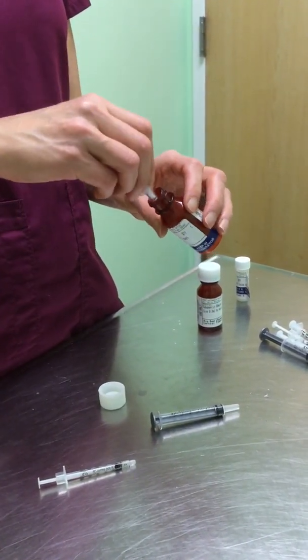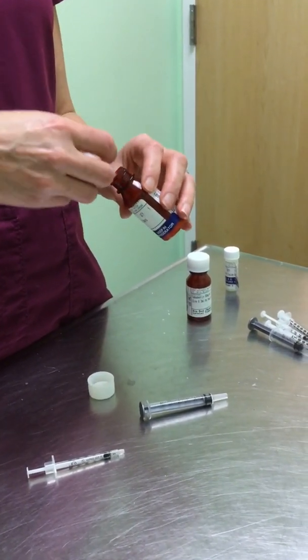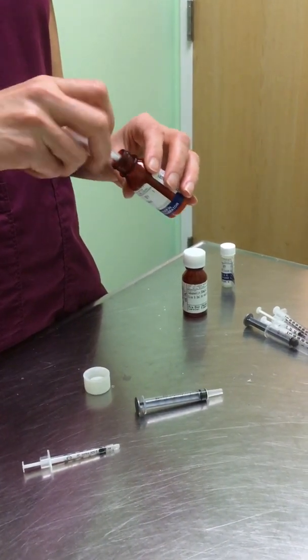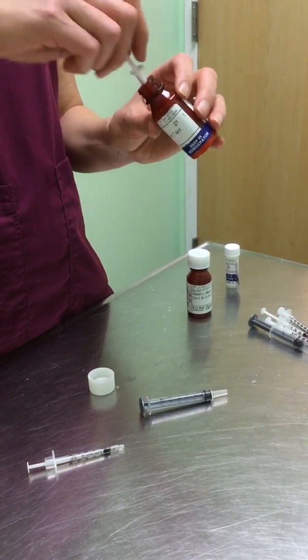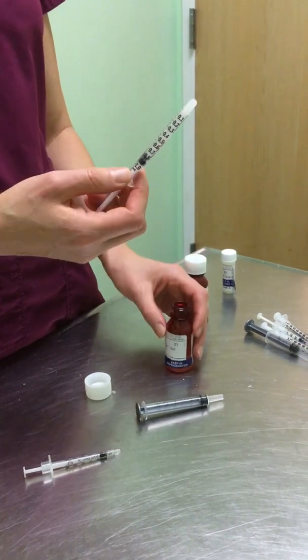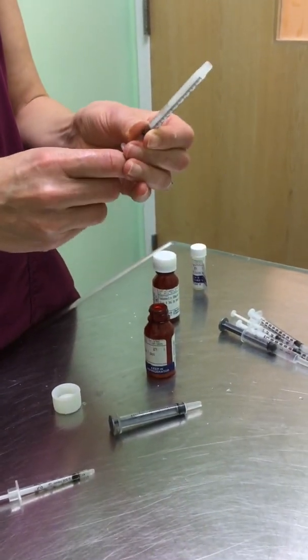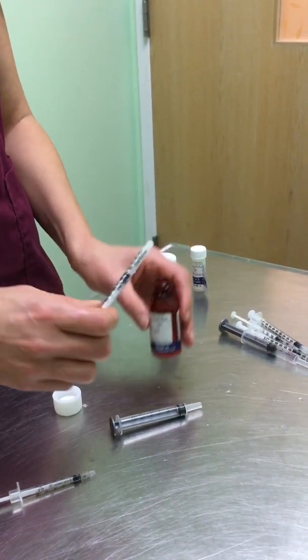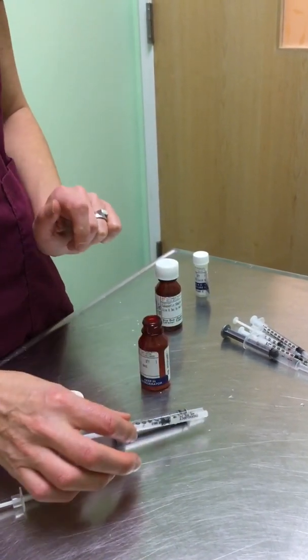So then you're going to take your syringe, you're going to dip it in. This is just for demonstration purposes. This is not real usable medication, in case you're wondering. And so say I want to use 0.5 mils. Oh boy, I don't even know if I have enough in here to show you. Oh. So again, I'm going to pull this out. You can see I've got some air in here. I'm going to tap it out, squirt the remainder out, and I'm left with 0.5 mils. Okay?